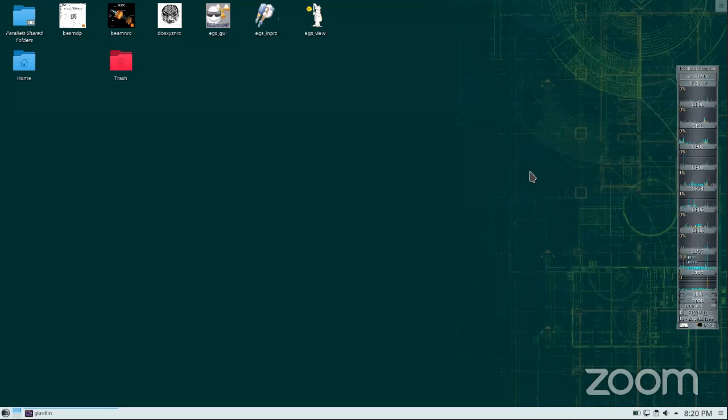Can you hear me? Yes, go ahead. If we measure the PDD data with the water phantom experimentally, and we want to compare that measurement data with the simulated data, then how can we? Well, you can use the RZ, right? But then you normalize everything to Dmax because you're measuring PDD.